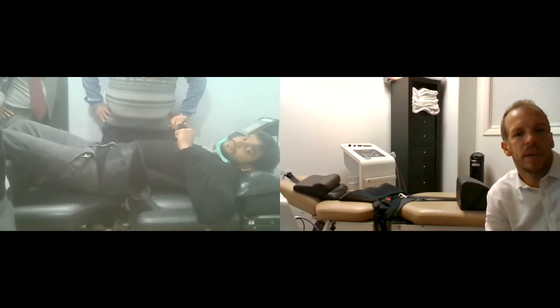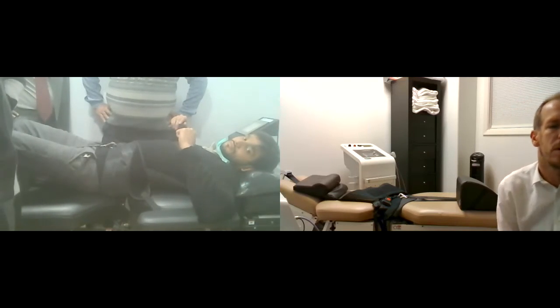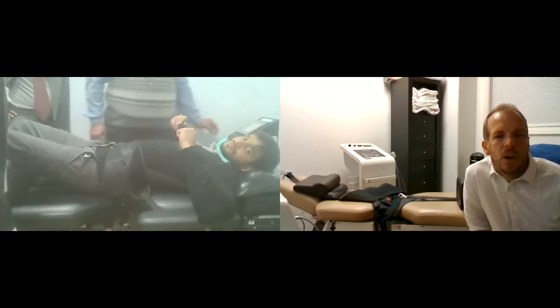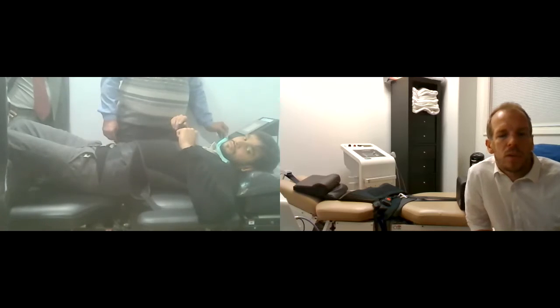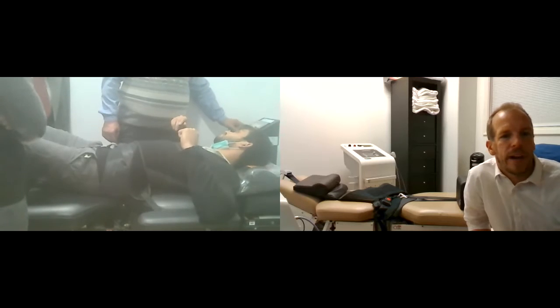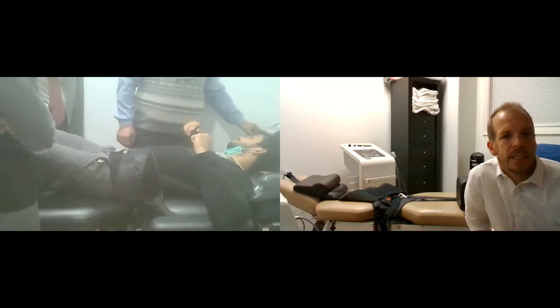Next, what we want to do is we want to choose our angle of pull. So now go ahead and go to the computer. Yeah. And then go to, you could choose, let's say we want to do L5S1. So go ahead and hit L5S1 and then begin targeting setup.